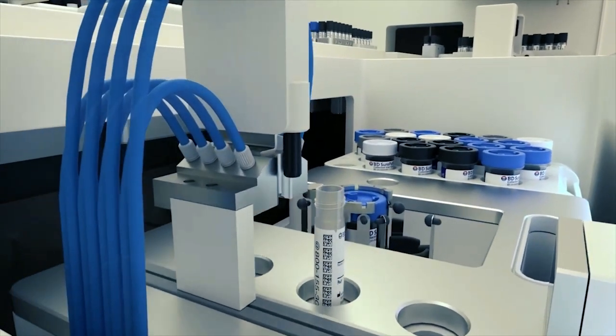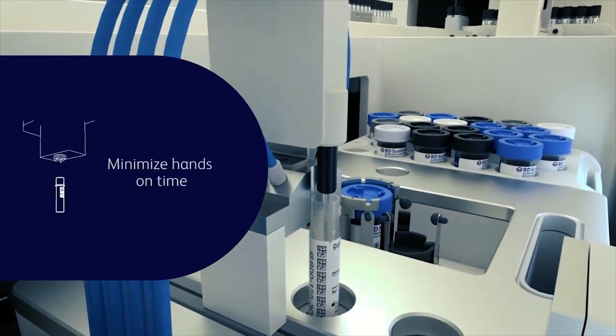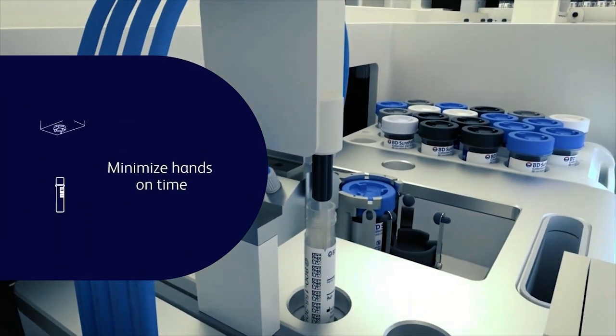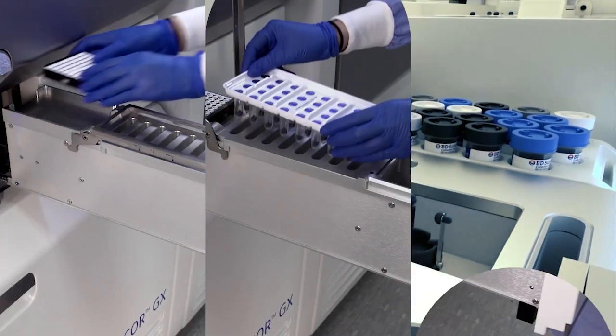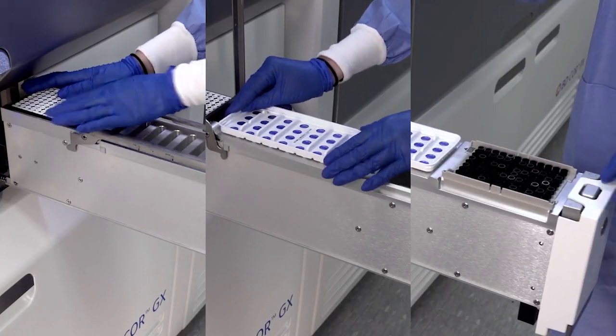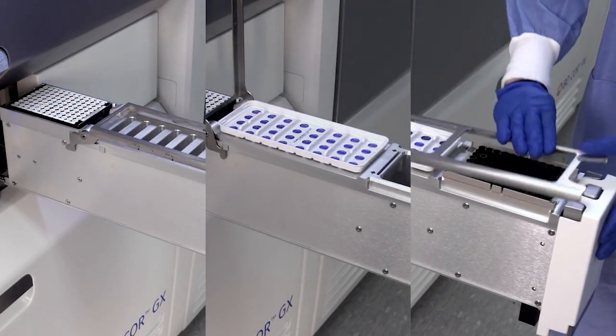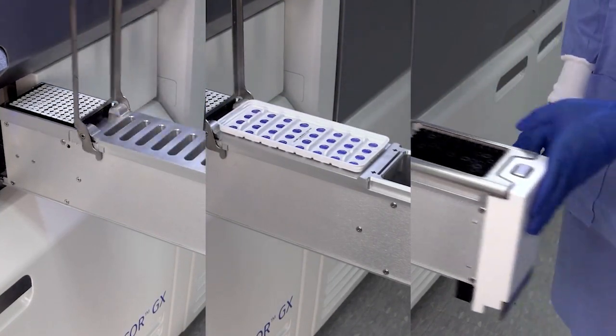The BD Core System is designed to minimize hands-on time. All reagents and consumables come in a ready-to-load format, no prep time needed.